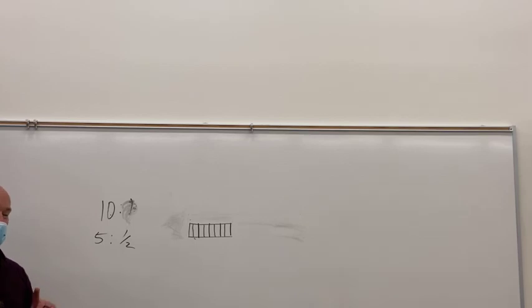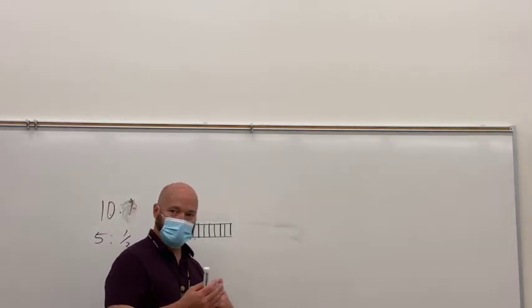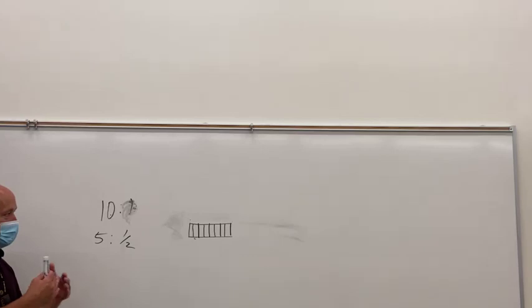Now, with these thinner buckies, what happens in a lot of cases is the bucky eats your marker, right? And I think that's part of the reason, because we've decreased the distance and made the entire bucky assembly a whole lot thinner than what it used to be.